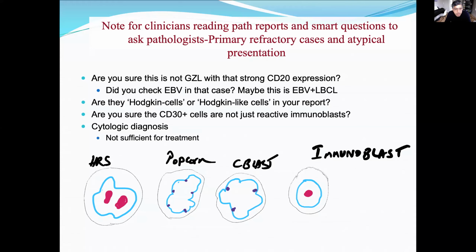No, you cannot make a diagnosis of even classical Hodgkin lymphoma without the basic stains. There are too many variations in Hodgkin's these days that impact treatment, so an excision biopsy is critical. NCCN does strongly recommend that you should do a biopsy regardless. And just to tell you, these are the variations of cells that you should remember.